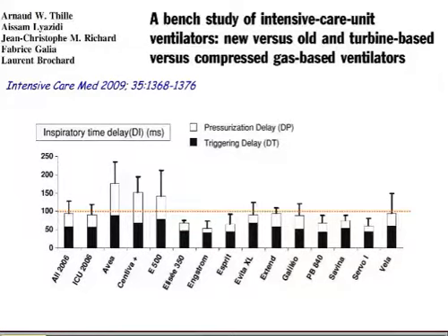So in case of triggering the ventilator, it means the patient should, and we don't know the clinical impact of this, by the way, but should at least be conscious of the inspiratory lag time before the ventilator responds. So all ventilators today, or most of them at least, have very sensitive triggers, and this issue of triggering sensitivity should no longer be a big problem.